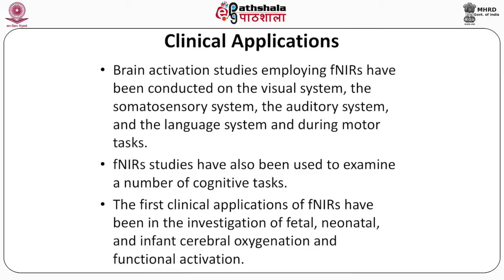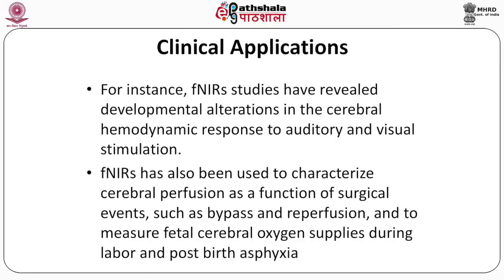The first clinical application of fNIRS has been in the investigation of fetal, as we have seen in the history, and neonatal and infant cerebral oxygenation and functional activation. So this is pretty useful for studying the cerebral oxygenation in the fetal and neonatal brain. Continuing with the clinical applications, fNIRS studies have revealed developmental alterations in the cerebral hemodynamic responses to auditory and visual stimulation. Again, this is more useful in fetal and neonatal brains.